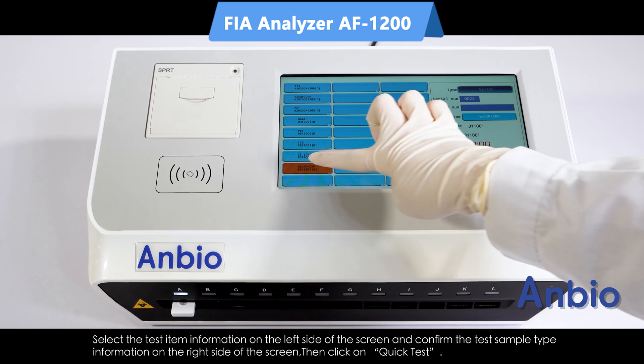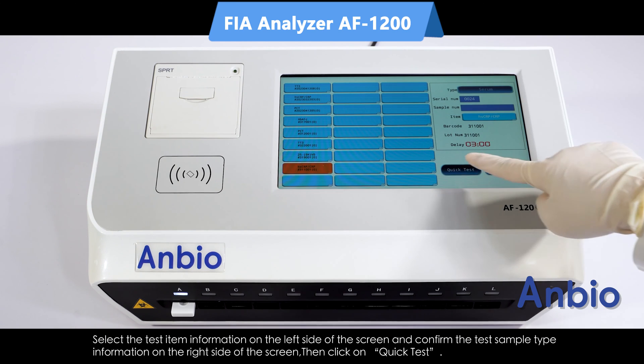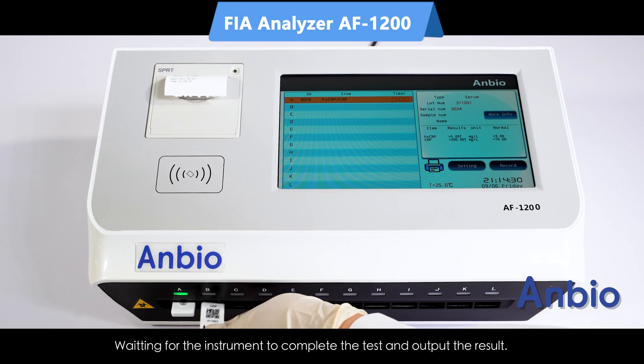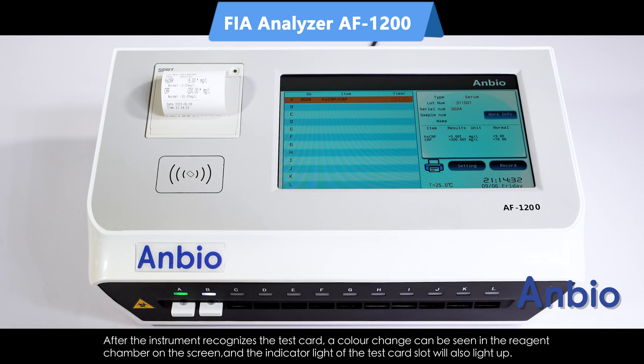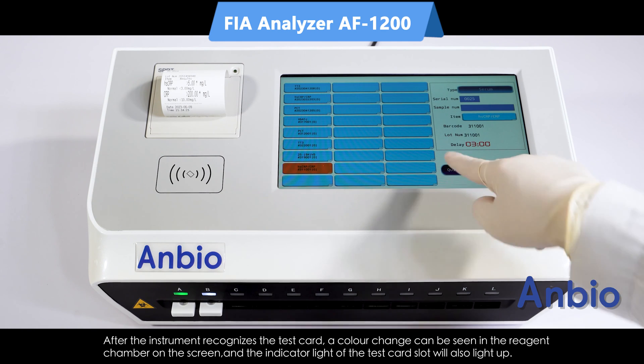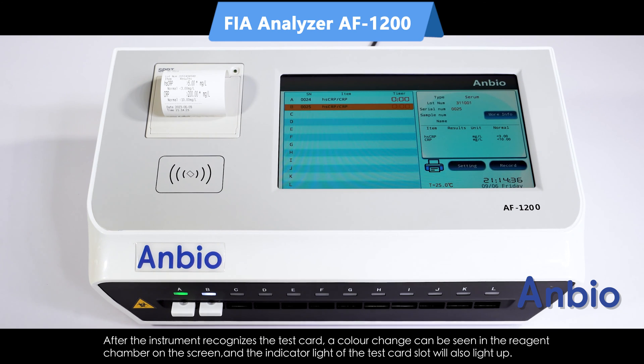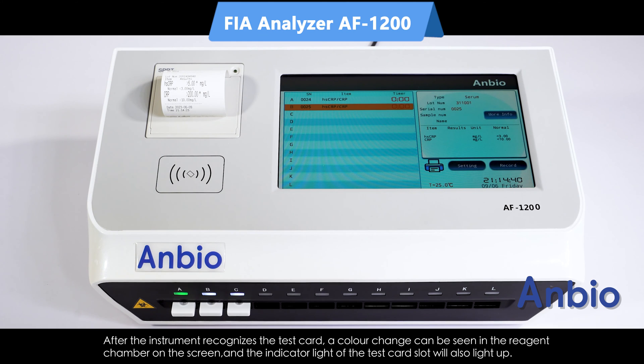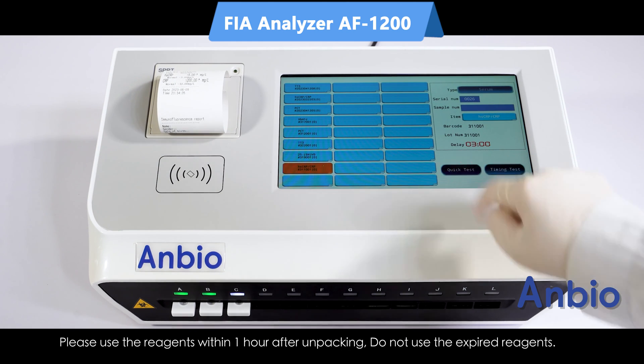After the test card completes the incubation reaction, insert the test card, then select the test item information and confirm the test sample type on the screen. Click the quick test button and wait for the system to complete the test and output the result. After the instrument recognises the card, the screen displays a colour change and the indicator light of the test card slot lights up.